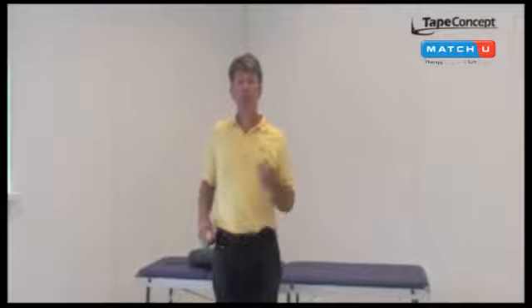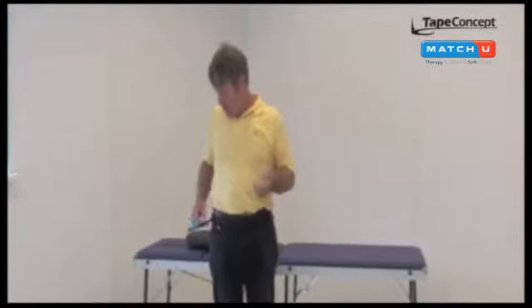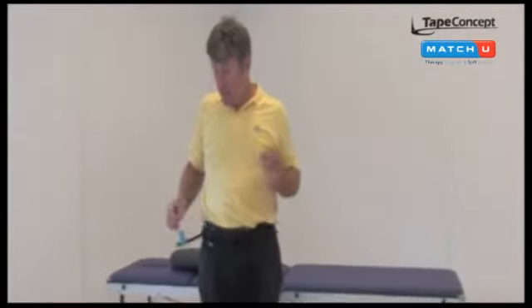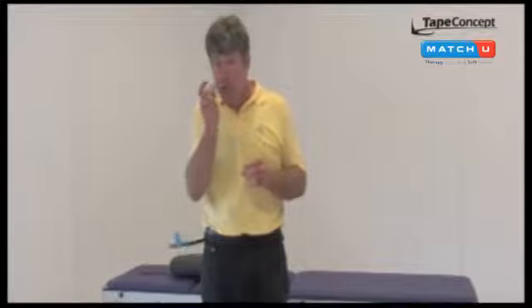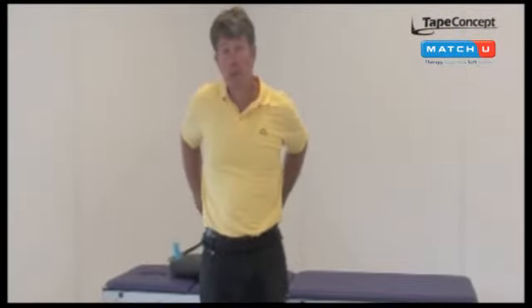The stabilization possibilities of the mini-motion are also suitable for the lumbar spine. One of the major directions you can exercise is rotation, since during walking we see a small rotation, and we know that walking is very effective. This rotation activates the local muscles around the lumbar spine, such as the transversus abdominis and the multifidus.